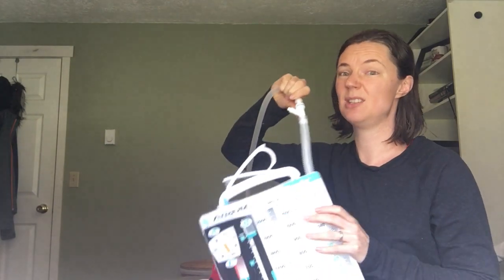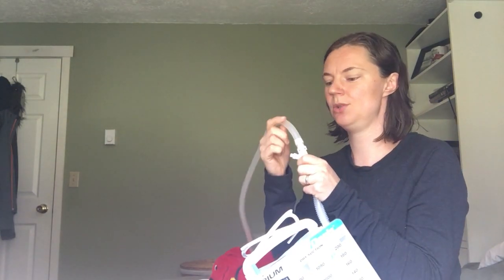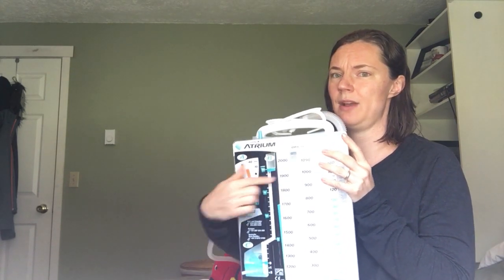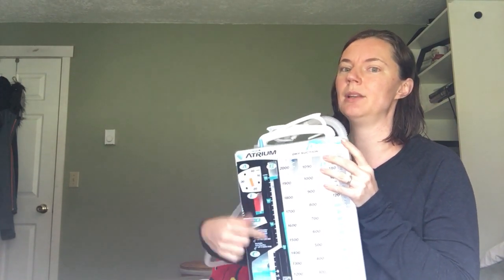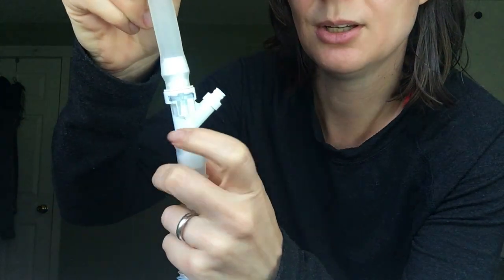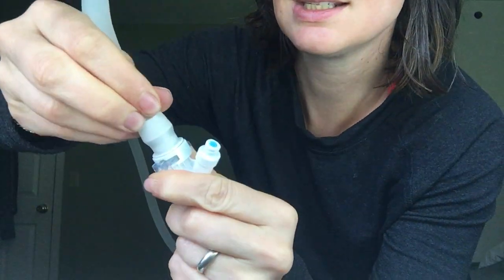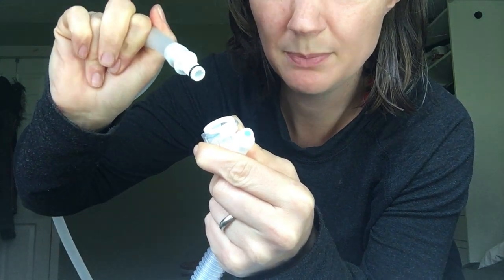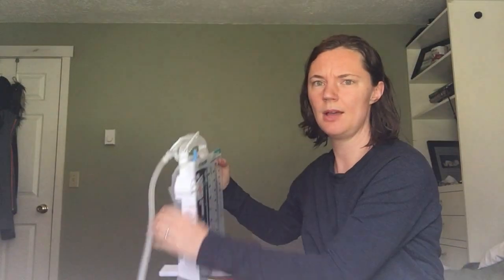But if for some reason it's too complex to figure out, or it's tipped too many times, or you have an ocean and these things did mix and you've got blue water in your blood and blood in your blue water, then most of our tubes have this quick connect piece right here, and you can just push this and it comes right out. You'll need to clamp the tube, have your new atrium ready, and just switch out the atrium. It's not that hard to change out the atrium, so don't freak out if it tips.